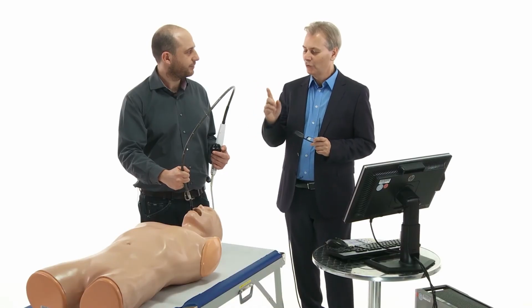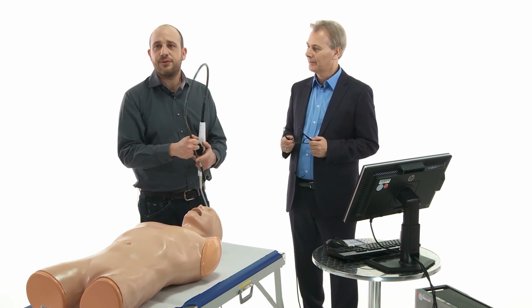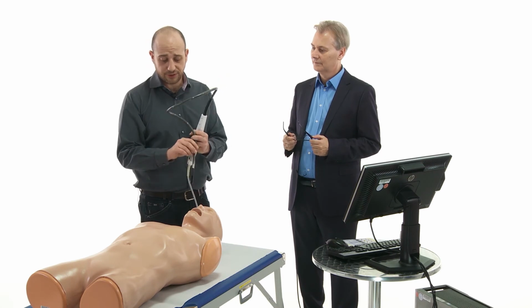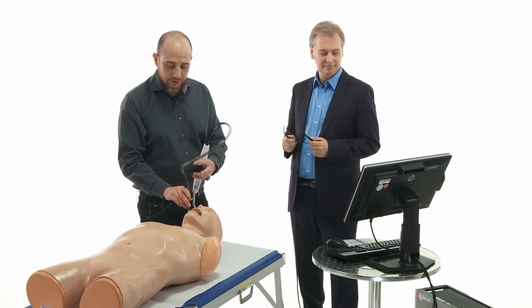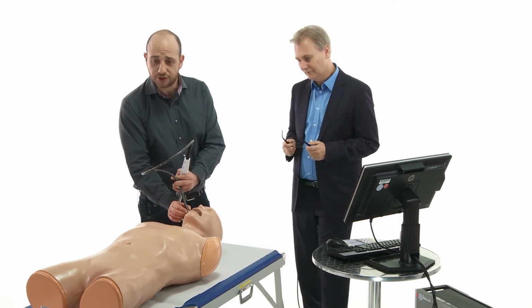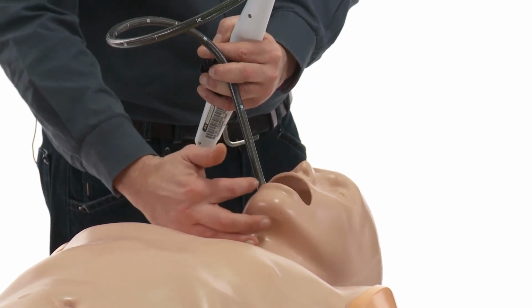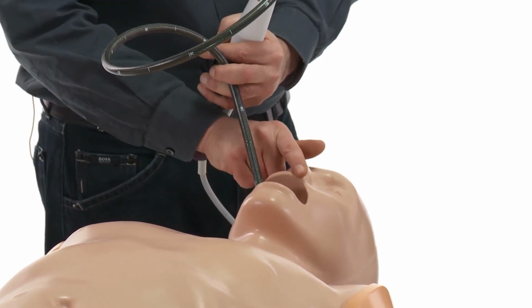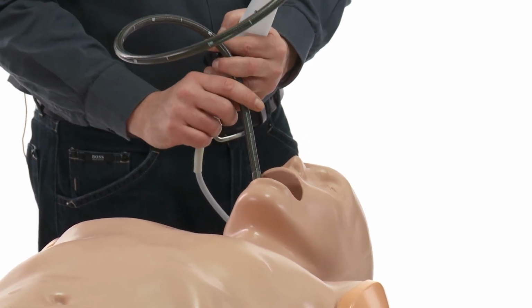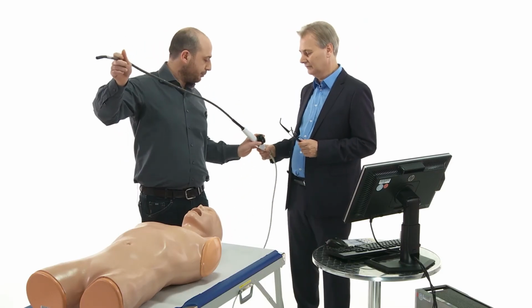The problem is... Wait, Bruno, one question. We always have the tube in the way. How do you take care of that problem? Exactly. Our nurses know that if this is the tube of the patient, we put the tube on the right side of the mouth in this position, and it will be fixed here. That means we have a very free place to introduce the TEE.